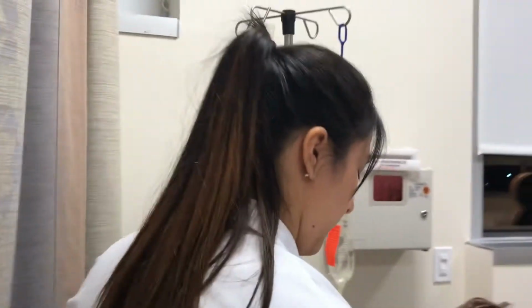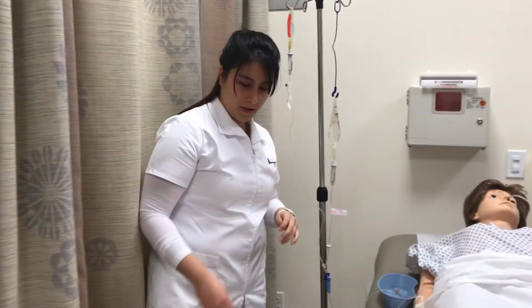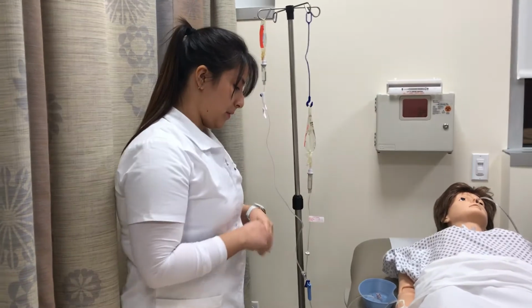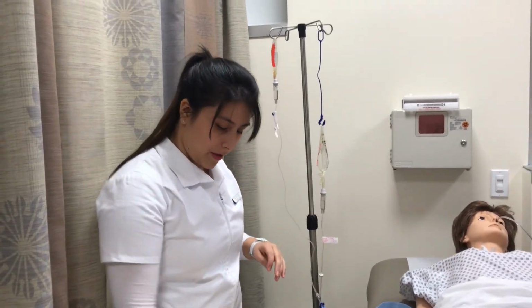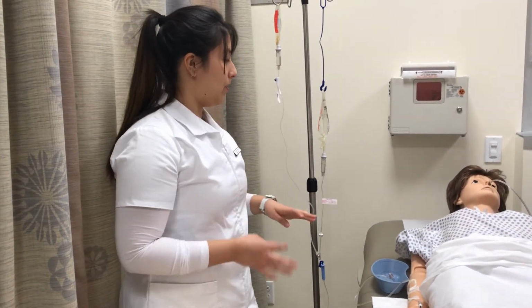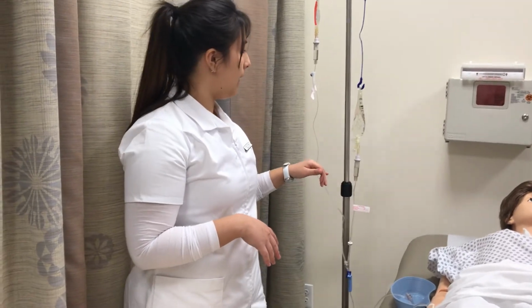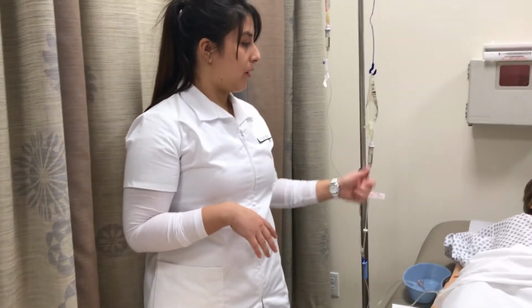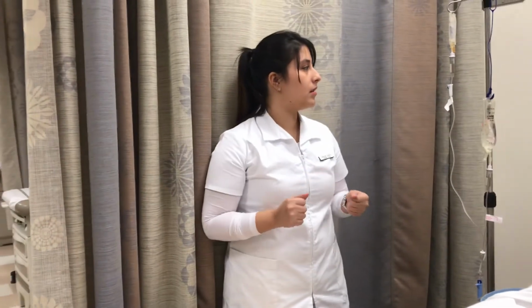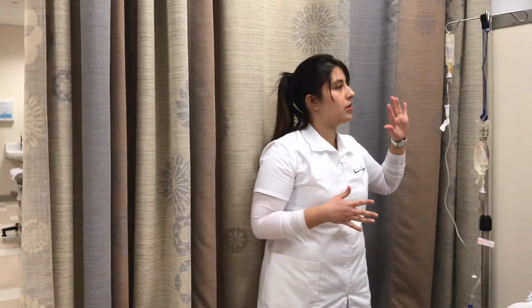Clean where they need. Okay. Laying this down, close the area. Okay, and since that is done, I will be gathering my equipment again, just throwing out, cleaning my area, making sure the patient is comfortable in a low position. I will be making sure that they have the call bell just in case they need something, and I'll leave the room and wash my hands. And I come back after I check that the medication is complete.